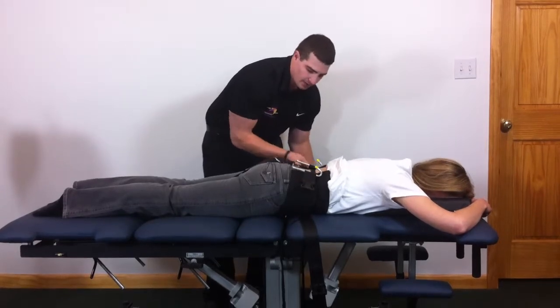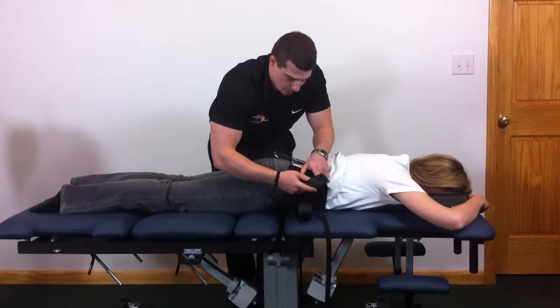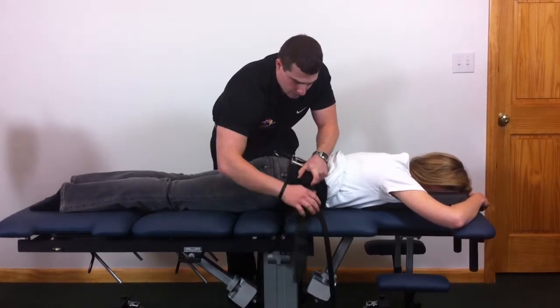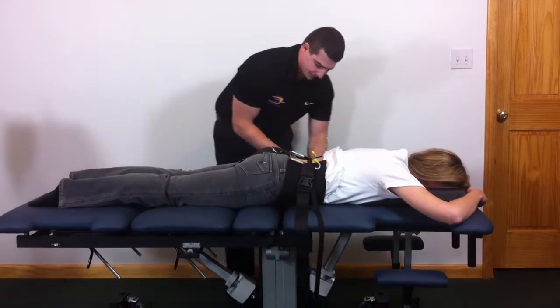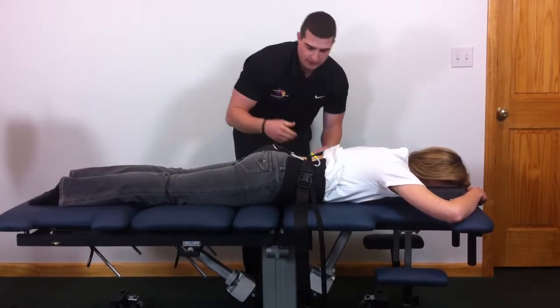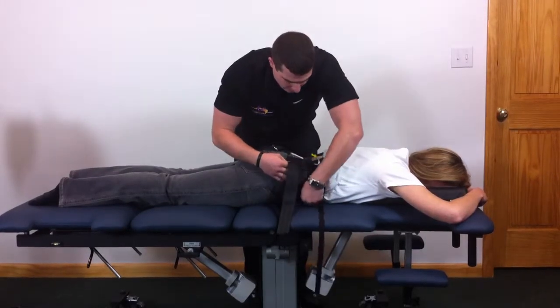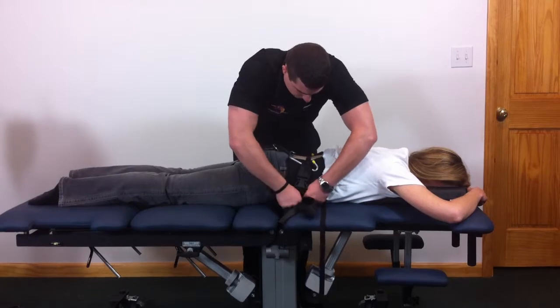Bring each clip on inside and connect them in. Give that a tug at first to snug it up some. Now you want to do a cinching motion on each side of the belt, where you grab the bottom strap underneath, force up, and pull down.